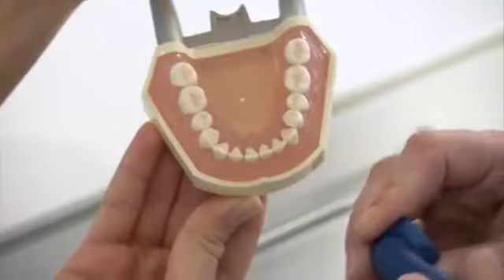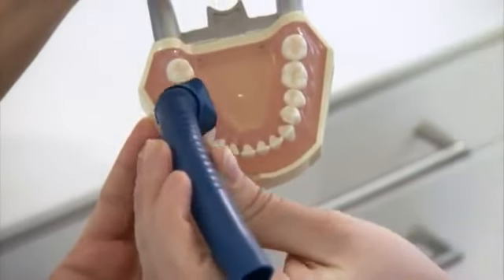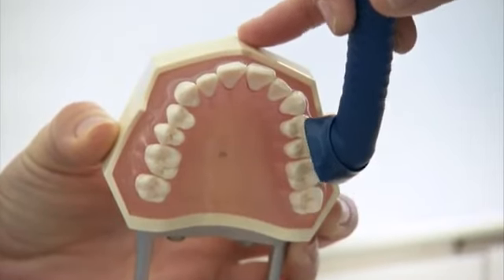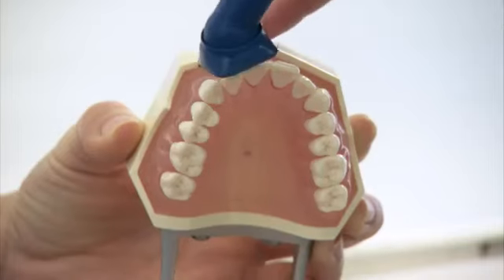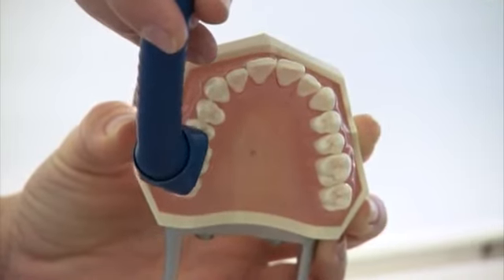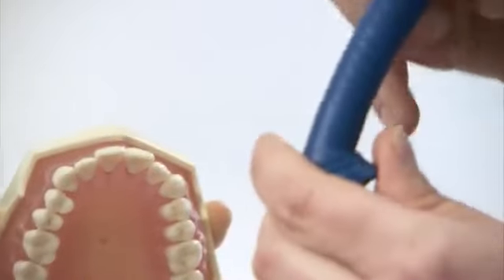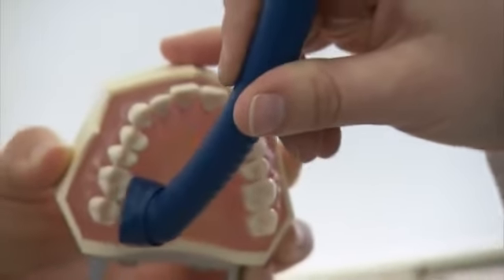When switching quadrants, the shield is relocated to the appropriate suction position to again ensure effective suction. The distinct side of the prophylaxis cannula shield is also oriented and set towards the gingiva for treatment within the upper jaw. The flexibility of the shield again provides for an optimal suction position from buccal to palatal.